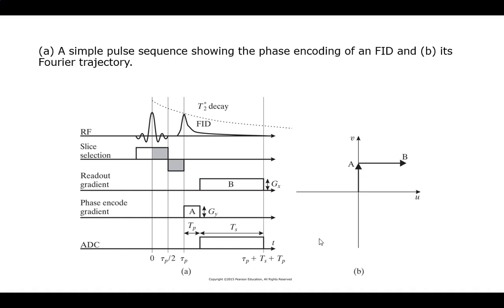By convention, we do the shifts on Y for the phasing, dephasing, and then we do the readouts along B. You don't want to shift these because when you're reading your points, you're literally just recording them into the matrix, writing the values down as your Fourier transform. So if you sometimes read this way and sometimes that way, you're going to get garbage. Does that make sense? Okay.